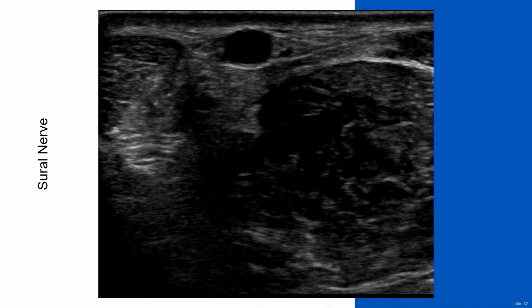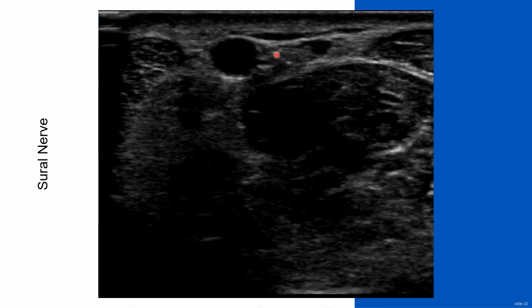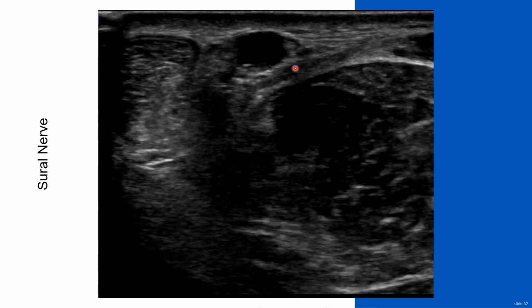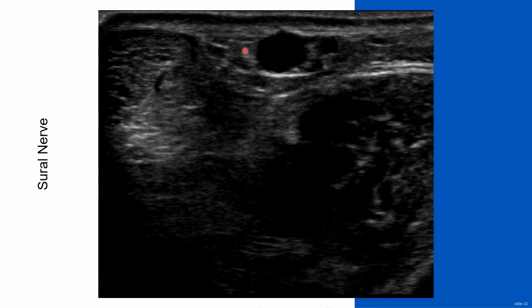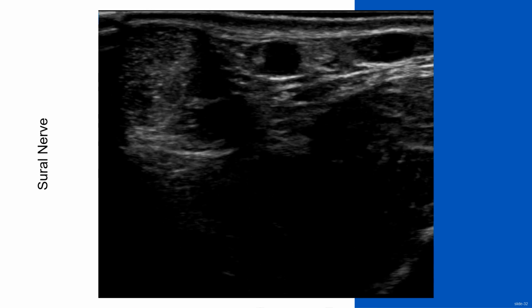This video will show the small saphenous vein and associated sural nerve. The small saphenous vein is extremely superficial with the nerve directly to its right. Injection in this tissue plane to get perivascular spread will result in reliable coverage of the sural nerve.